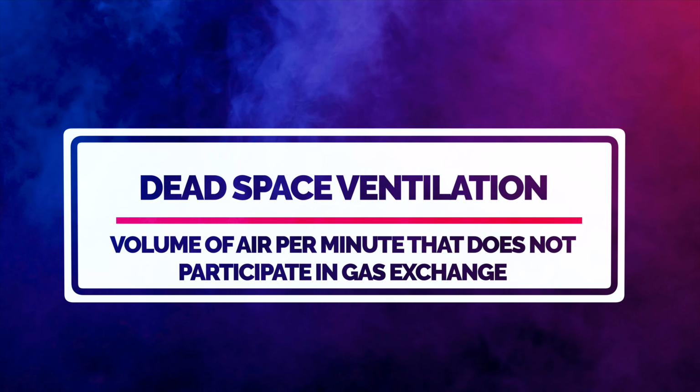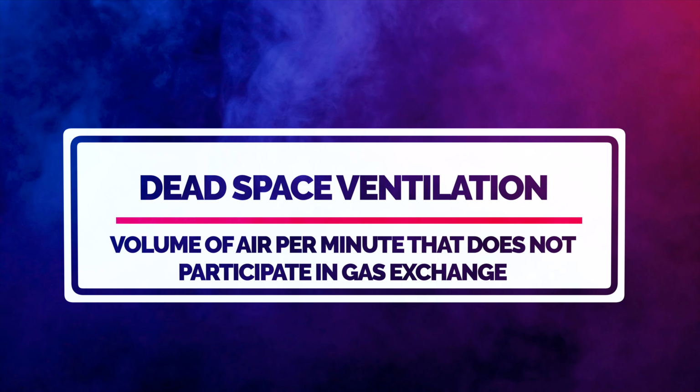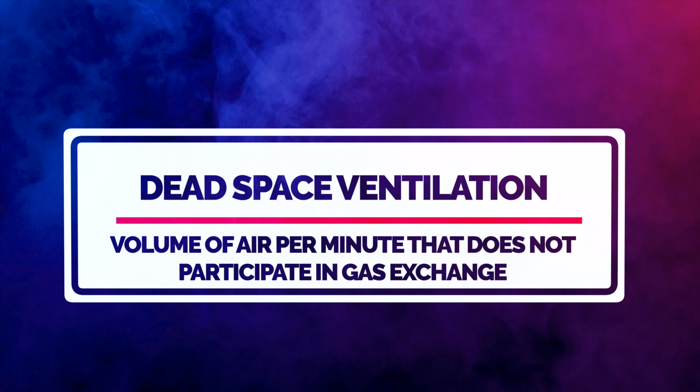Dead space ventilation is the volume of air per minute that does not participate in gas exchange.